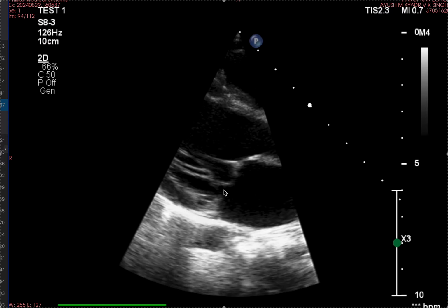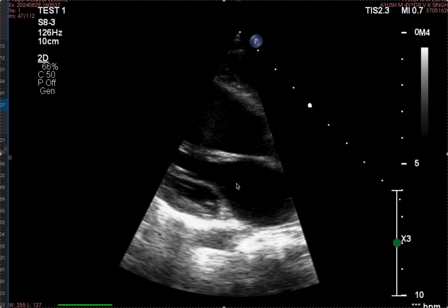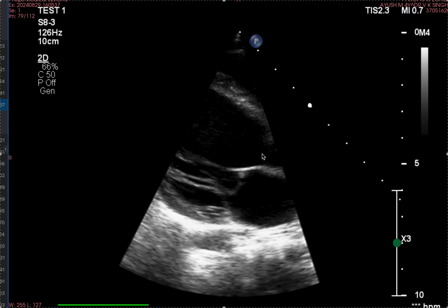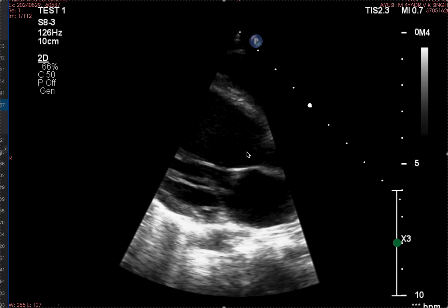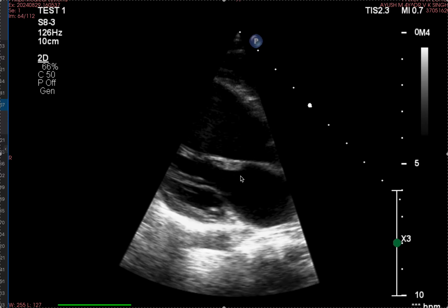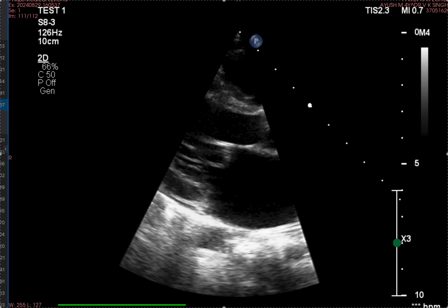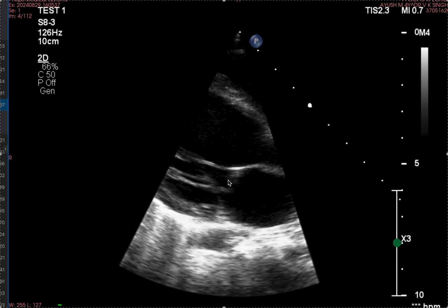Anterior mitral leaflet prolapse. You find the portion of the anterior mitral leaflet bulging into the left atrium, that is, superior displacement of more than 2 mm from the plane of the mitral annulus. In this case you can easily see this anterior mitral leaflet. I want to point out that this portion has bulged into the left atrium. The left atrium is superior compared to the left ventricle. So superior displacement by more than 2 mm is called mitral prolapse.